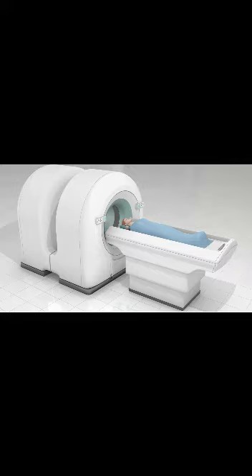What types of illnesses and conditions is PET used to diagnose? A PET scan is an effective way to help identify a variety of conditions, including cancer, heart disease and brain disorders. Many types of solid tumors can be detected by PET-CT and PET-MRI scans, including brain, breast, cervical, colorectal, esophageal, head and neck, lung, and lymphatic system.